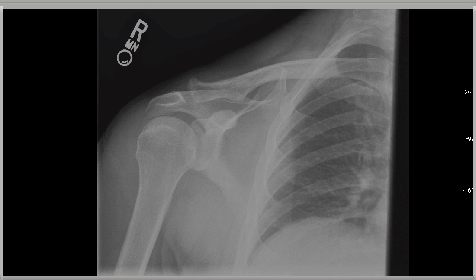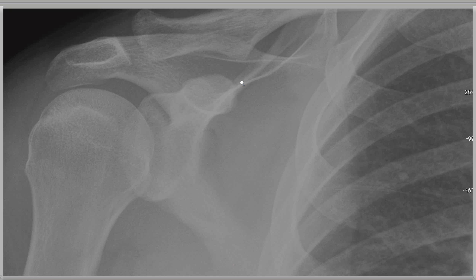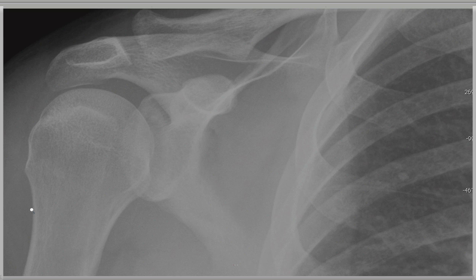In this module we will review the basic radiography of the shoulder including four projections. This is the standard frontal or AP projection in which case we see the standard three main bones of the shoulder girdle: the scapula, the humerus with humeral head, and the distal clavicle. Zooming in, we can see that the humeral head in this instance looks somewhat like a light bulb, which indicates it's in internal rotation.